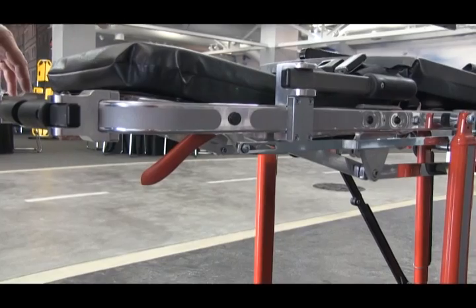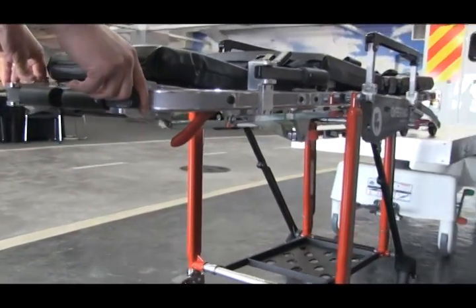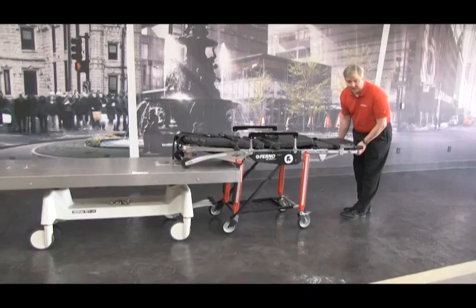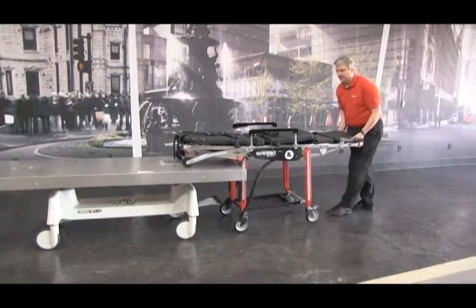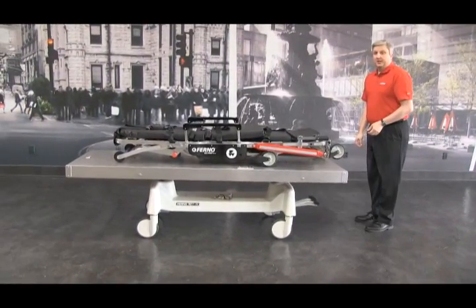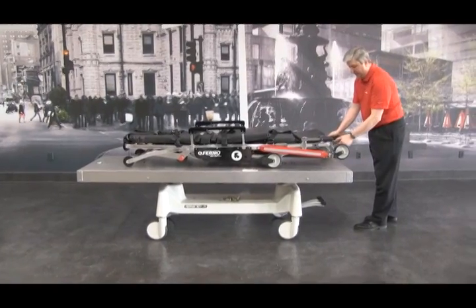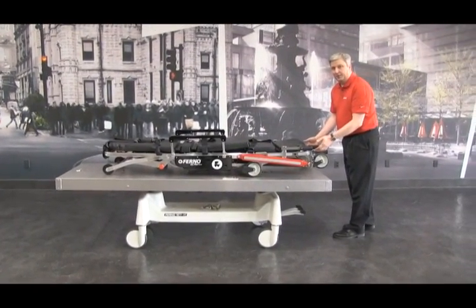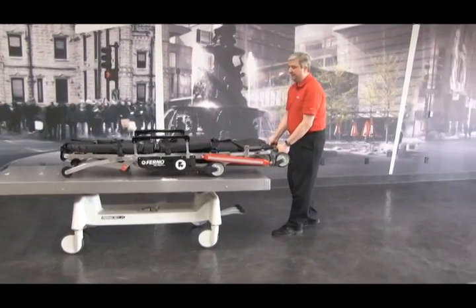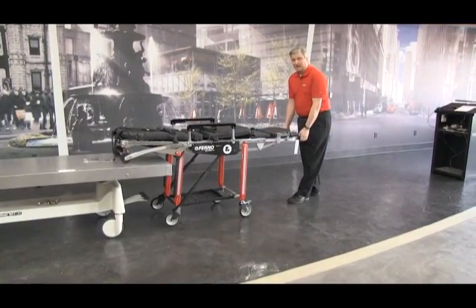To load the cot, there's a red release handle on the operator's side. Bring the cot to the back of the vehicle, pull the red release handle which releases the front legs, and load the cot. To unload the cot, use the flip-out handles — no handle needs to be pulled. Pull the cot out of the back of the vehicle, place it down automatically, and it locks into place.